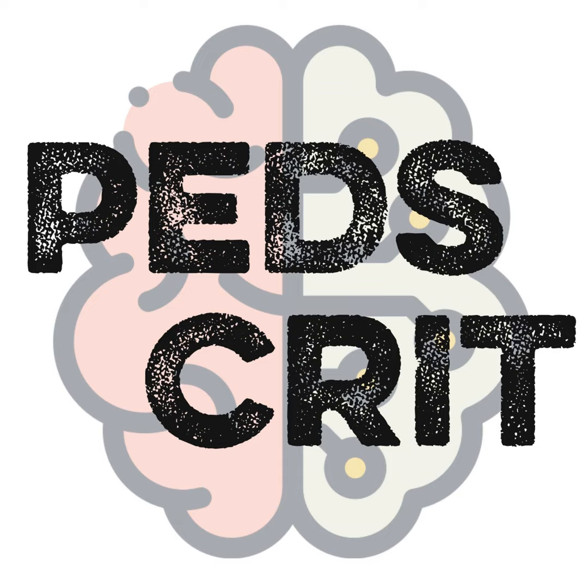It's the circuit trying to get more flow, but not being able to achieve it. So either you're asking for too much flow, or the cannula is too small, which is not usually the case because we are pretty good about getting the right cannula in, or there's not enough volume, or you need to back off and stop asking for so much.